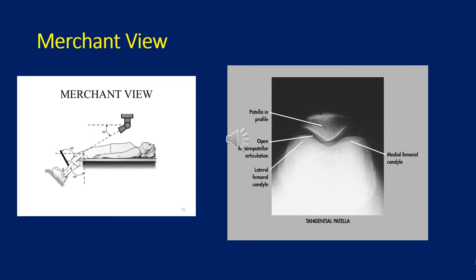One of the most important views that can be ordered is the merchant view. It is perhaps the most forgotten view, because most doctors would just order an AP and a lateral view. However, the merchant view shows the patellofemoral joint very clearly. You can see here that the knee is bent 45 degrees and the beam comes from the top down to really isolate that patellofemoral joint.